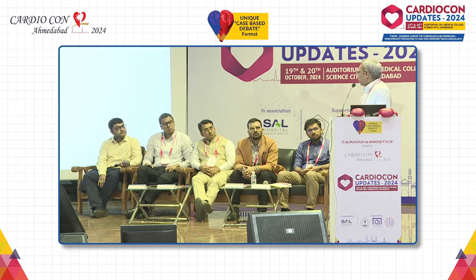The patient has syncope, but no documentation of any arrhythmia except some pauses which are very non-specific. So what I would like to do in this is to have a study tell whether there is a conduction disease, intrahisian or infrahisian, and I would still place a pacemaker.